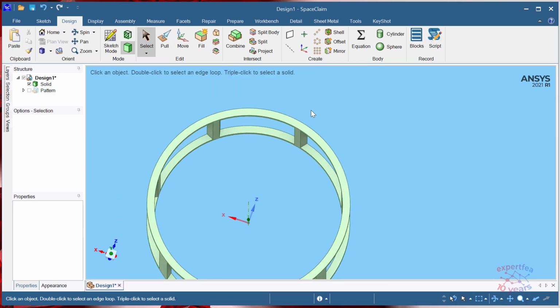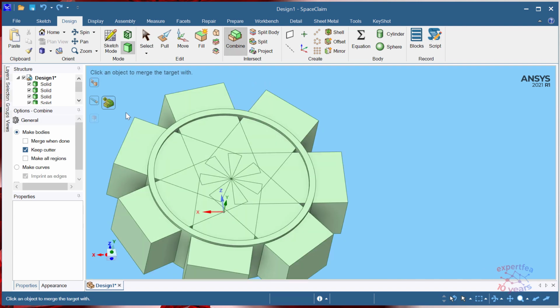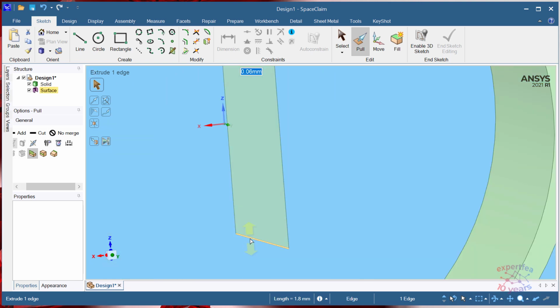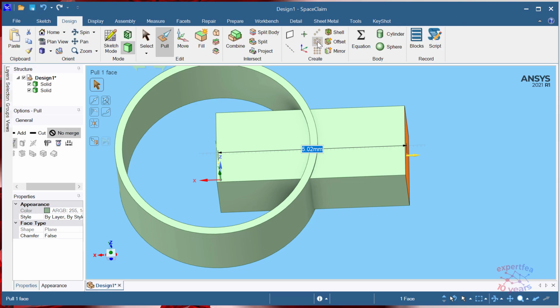So what should we do? Maybe let's make the initial parallelepiped a little bigger, yes. So let's undo until we get to the initial parallelepiped. Ctrl Z, Ctrl Z, Ctrl Z, and we have this thing. So let's pull this here, 0.06, and here let's pull the same 0.06. I'll click no merge, then pull this here and repeat the pattern operation, circular pattern.